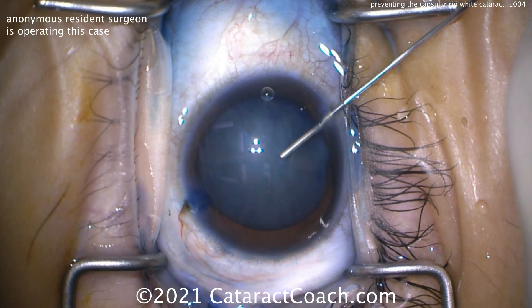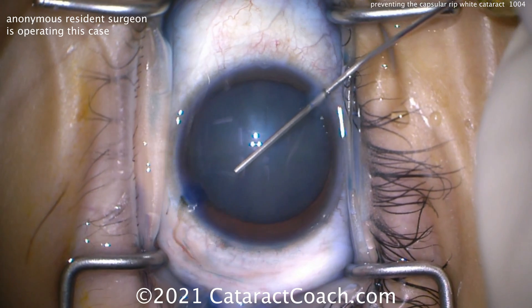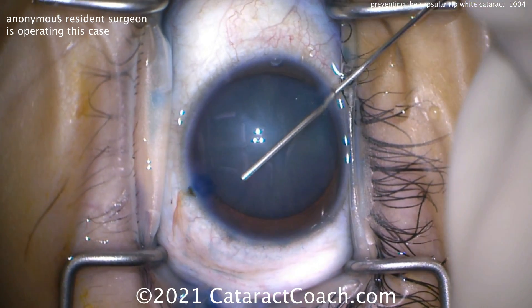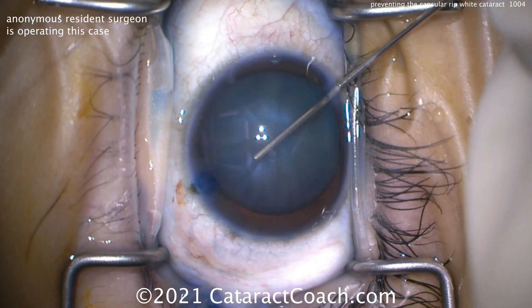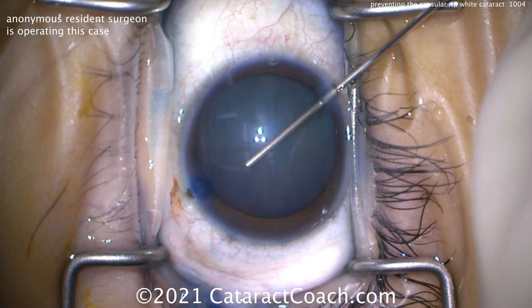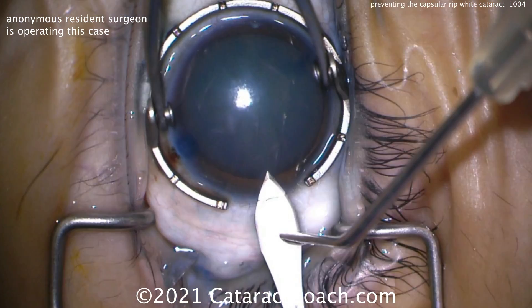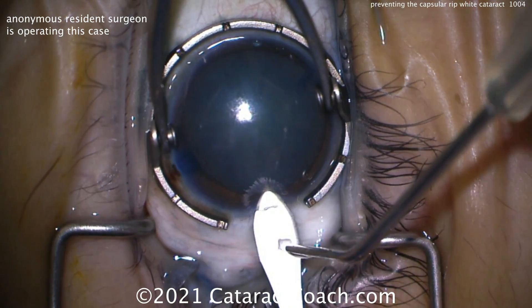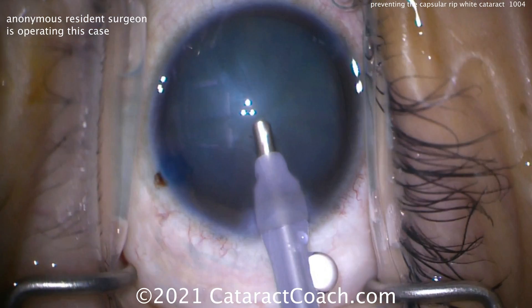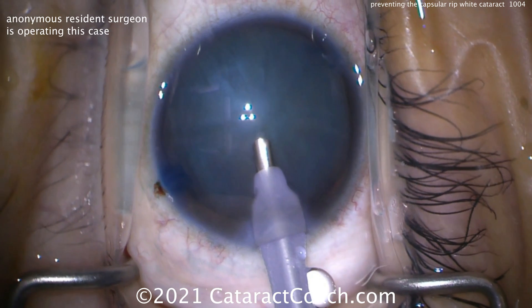So now this is the same patient in the second eye, and it's the same thing. When we touch that anterior lens capsule, look how pressurized it is — the whole lens capsule is pressurized. The pressure in the capsule bag is much higher than the pressure in the anterior chamber. It's a white cataract, but there's no liquefied intumescent fluid. The whole lens is swollen. So we're going to buzz in with a phaco probe and create a central opening.